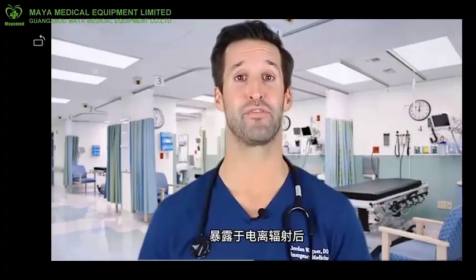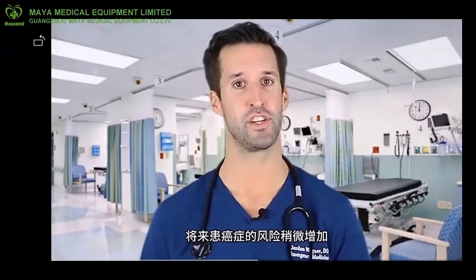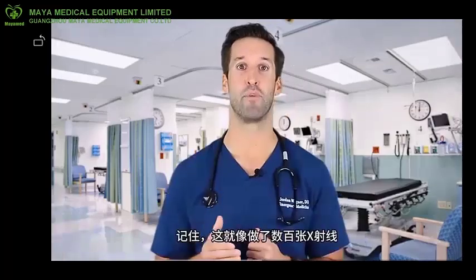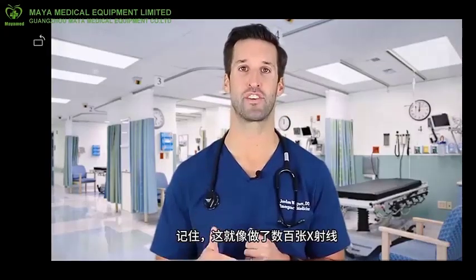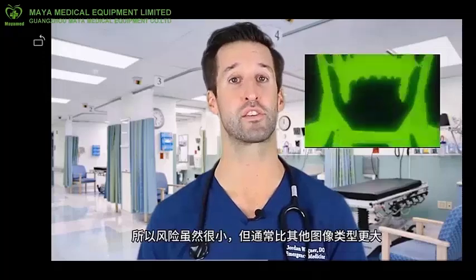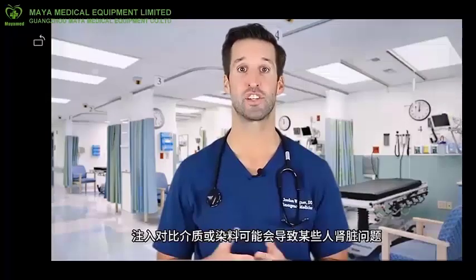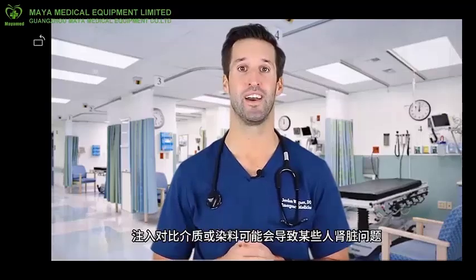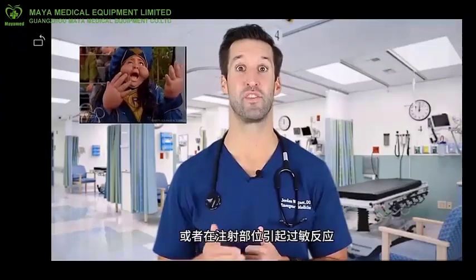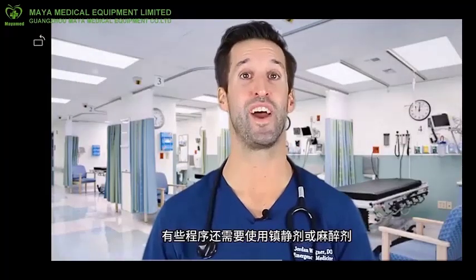Disadvantages: small increased risk of cancer in the future from exposure to the ionized radiation, just like X-rays, and the risk is also greater in children. Remember, it's like having hundreds of X-rays. It uses higher doses of radiation than the plain X-rays, so the risk, although small, is generally greater than other image types. Injection of contrast medium or dye can cause kidney problems or result in an allergic or injection site reaction in some people. Some procedures will also require sedation or anesthesia.